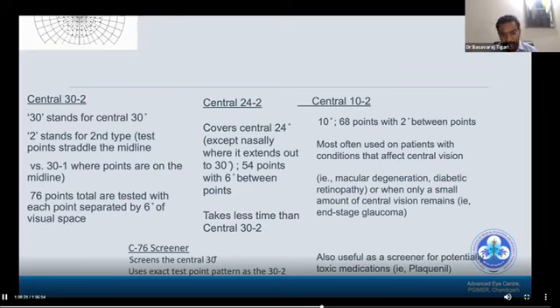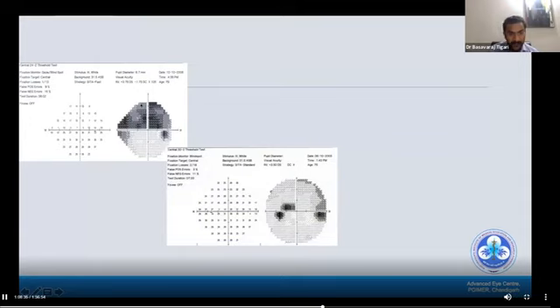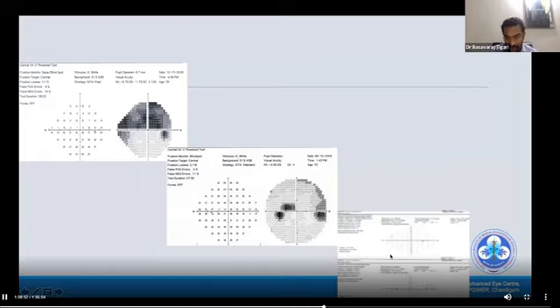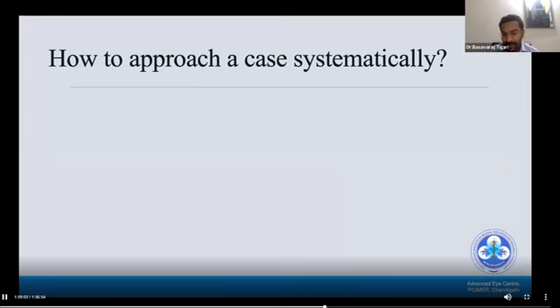This is a 24-2 grayscale visual field printout showing 24 degrees in all quadrants except the nasal side where it depicts 30 degrees. The 30-2 gives 30 degrees in all four quadrants. This is the 76 screening point printout. I apologize for the poor image quality.